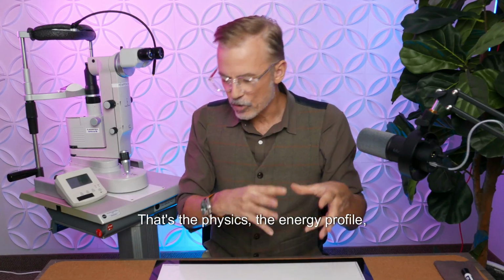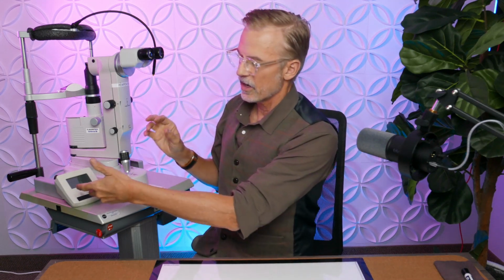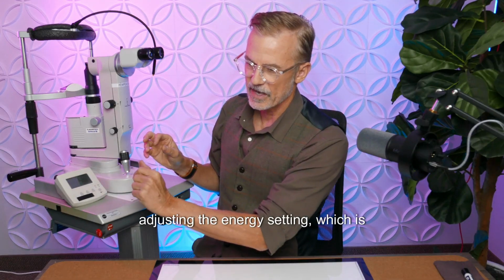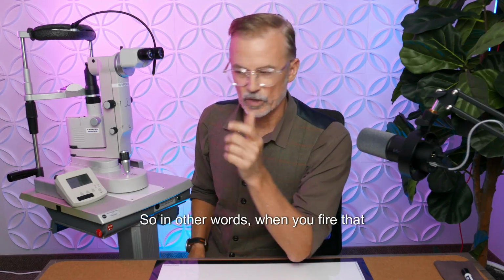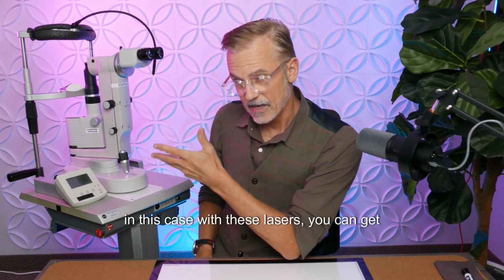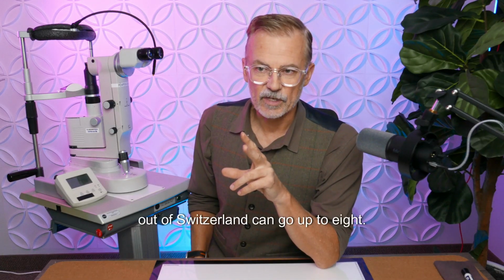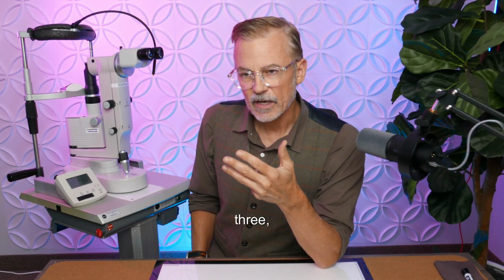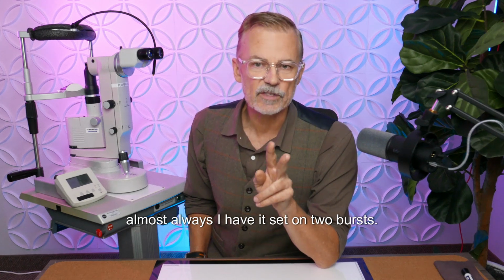That's the physics, the energy profile, which is the cone there. The options are mostly adjusting the energy setting, in millijoules, up or down. You can also adjust the bursts per shot. So when you fire that trigger, with these lasers you can get 1, 2, or 3 bursts per shot. The YAG out of Switzerland can go up to 8. Although mine can do 3, almost always it's 2. I have it set on 2 bursts.